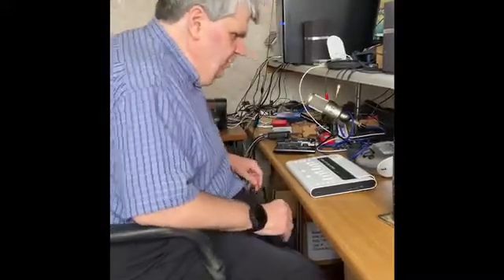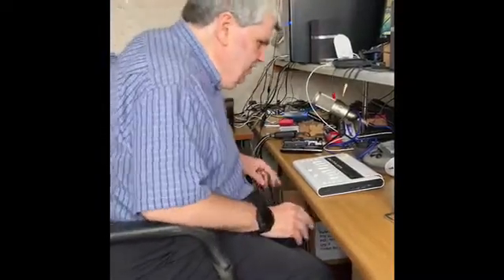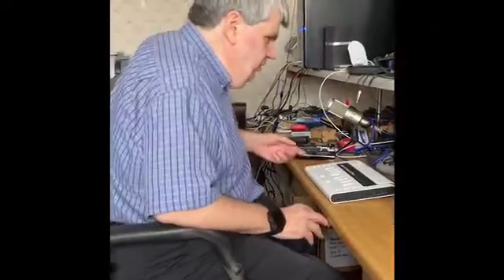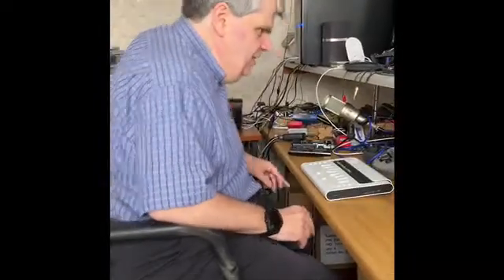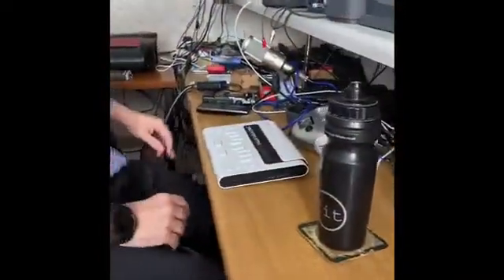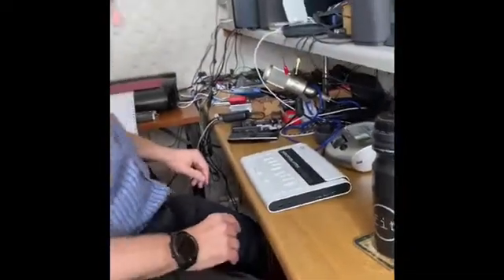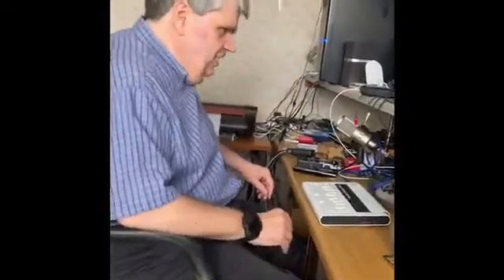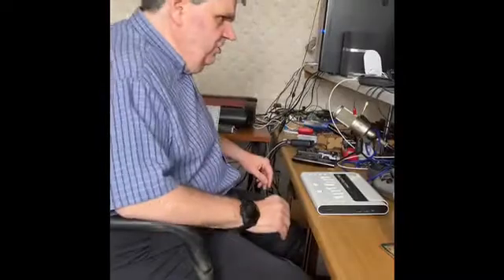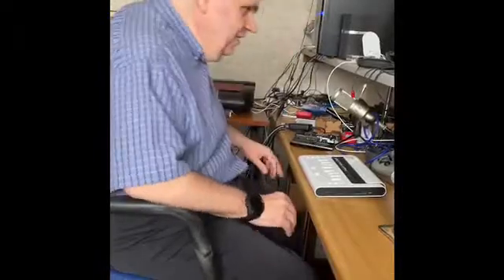And the final environment, I said there were 3, is, in fact there are 4, just thought of another one. You can also connect this to a Braille display, to another computer, and use it as a dumb terminal. That is to say, you can connect it to a PC in the school or the office or the workplace, and then you can have JAWS run it as a dumb Braille display. And the final environment is iPhone, Android phones. You can connect them via Bluetooth and use it as a dumb Braille display as well. So you can send your text messages by inputting in Braille, and it comes out on your phone desktop. Is there anything it can't do?